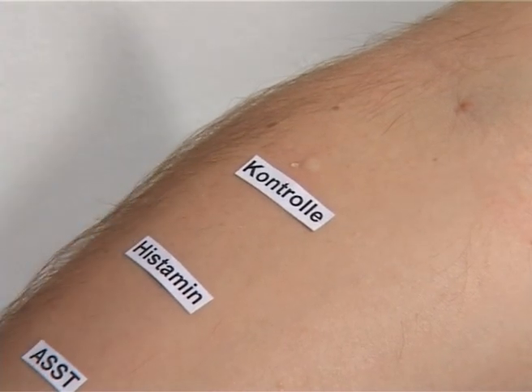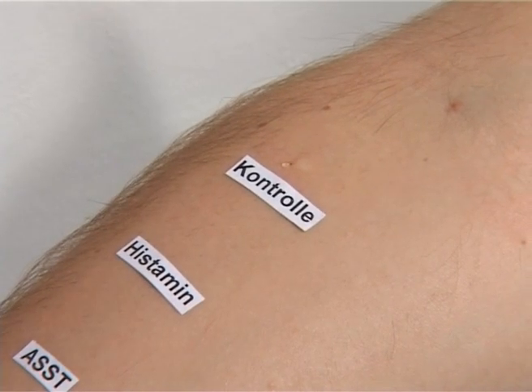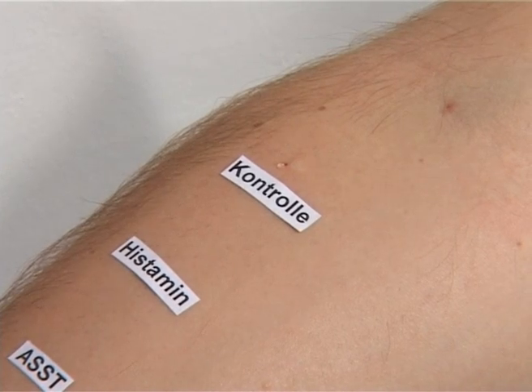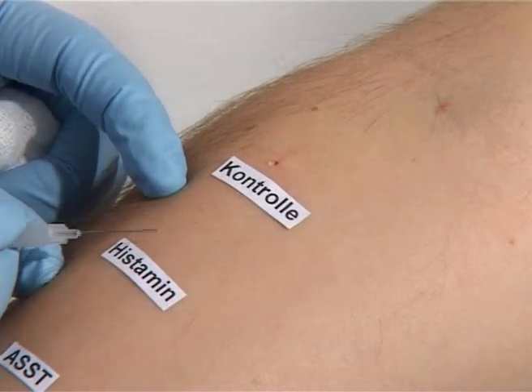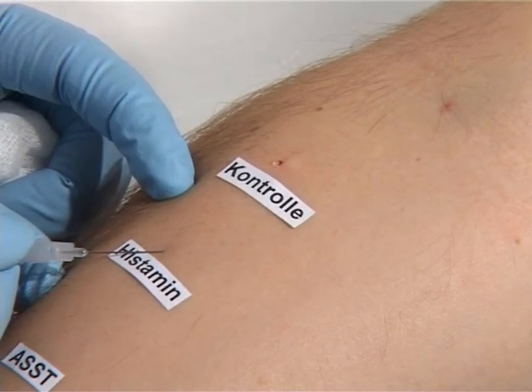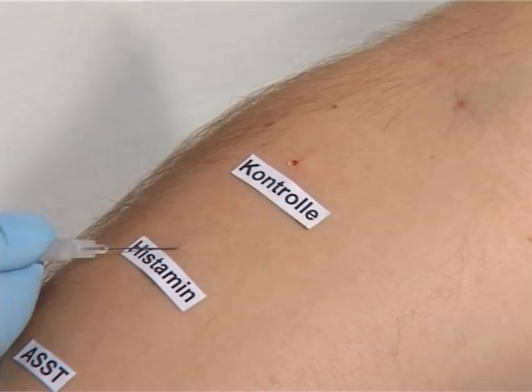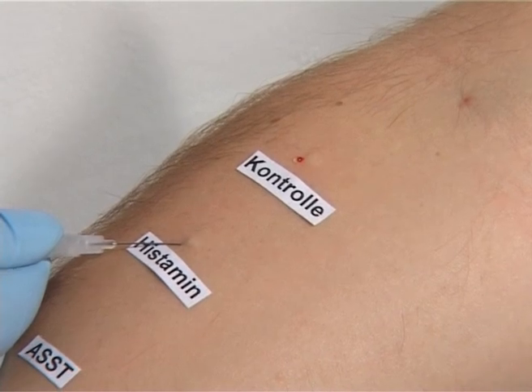Analogous to the usual intercutaneous testing procedure, the testing occurs on the volar lower arm after a disinfectant has been sprayed on. The three testing areas are labeled before the injections. The three test areas should be at least 4 cm apart.